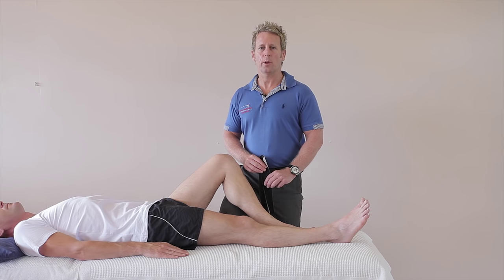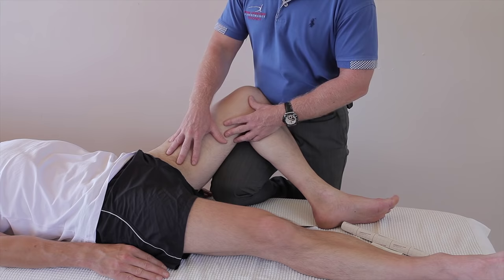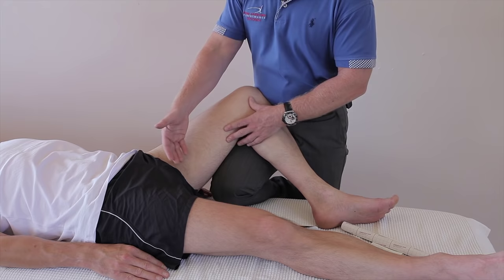In this video we're going to look at taping for a strain of the adductor muscle group. When patients have pain on the medial side of the groin and inner thigh area, it's very common to be coming from the adductor muscle group. Just rule out any pathology from the lumbar spine and in particular the hip, because the hip will give you pain in this area of the adductor and the groin.